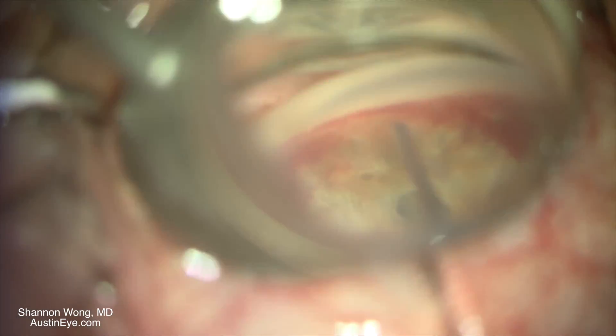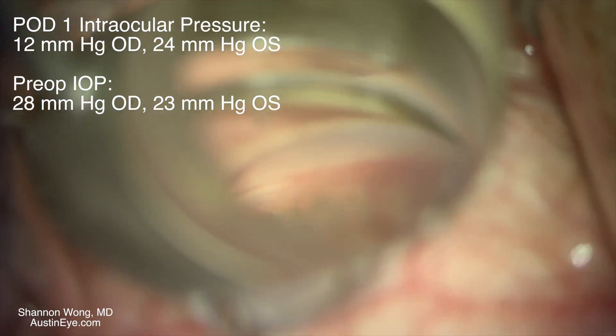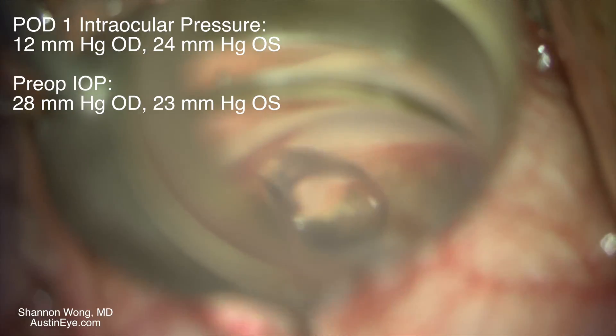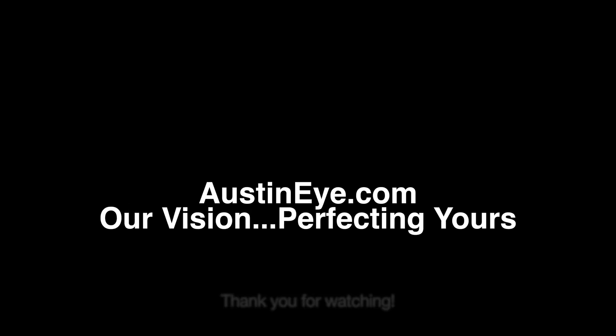We then use viscoelastic again to viscodilate Schlemm's canal and the collector channels. This patient's intraocular pressures came down nicely on postoperative day one. Thank you for your time and attention.